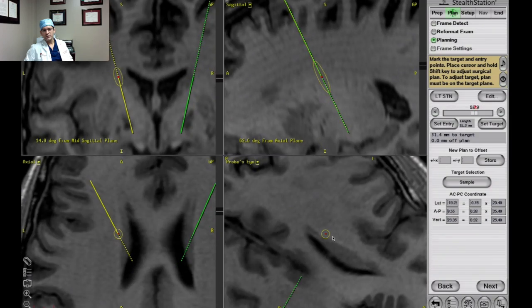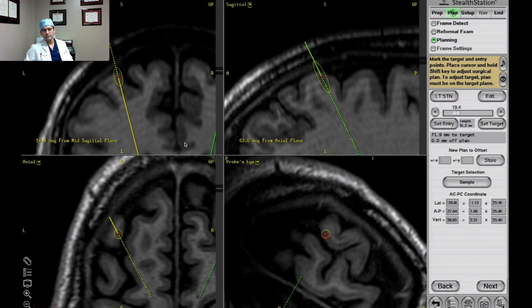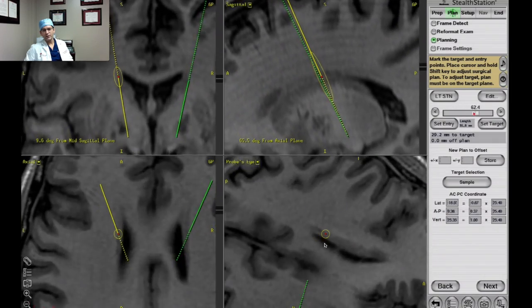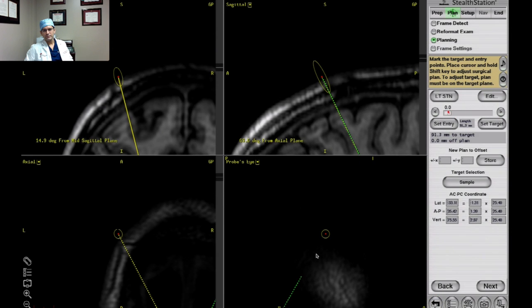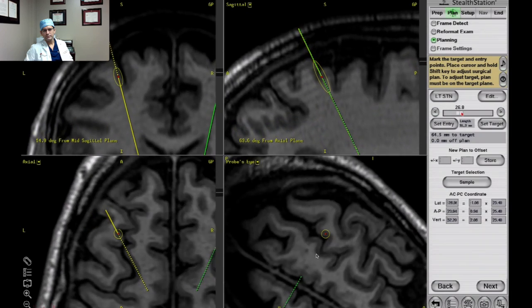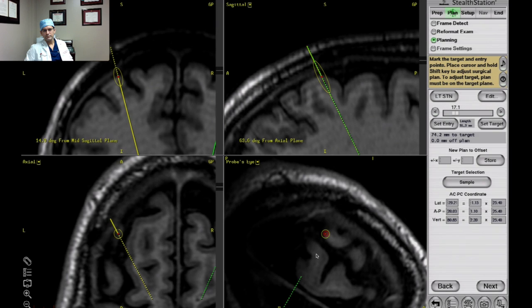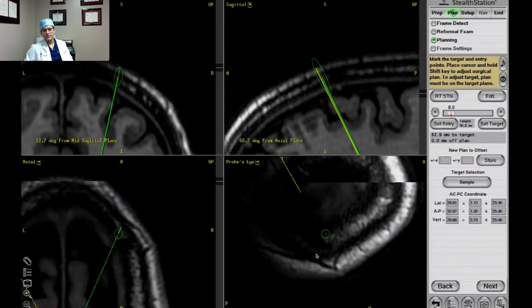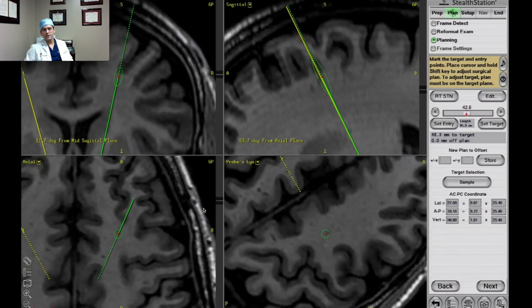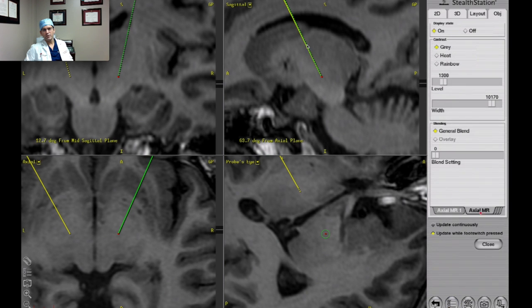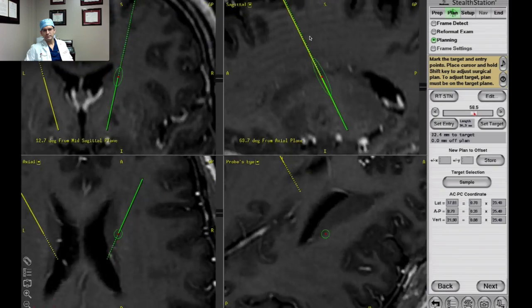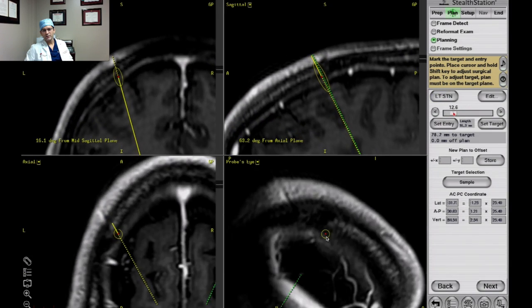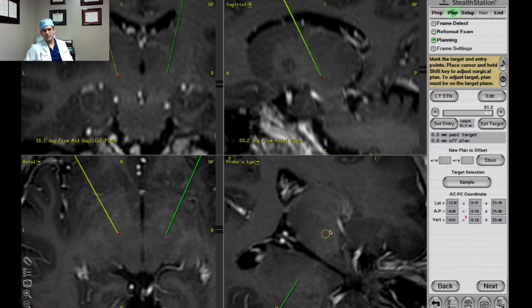Again, looking to see how I'm traversing this. Another thing I'm looking at with STN is how close I'm getting to the ventricle. I'm exploring to see if I go to a more medial gyrus how that looks — and I don't like that, so I'm going to go back. I'll bring it so it's centered a little bit more on that gyrus. Double checking again that I like my right — you can see the two trajectories are pretty well aligned; one's green, one's yellow, and they're overlapped in this sagittal image. Now I'm looking at the blood vessels; I can see I'm kind of clipping a sulcus, but that was on the other side, so I leave that.